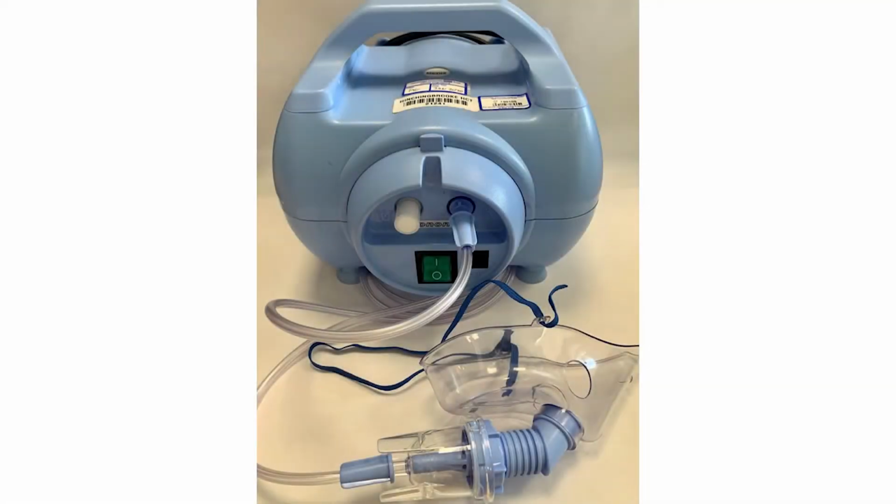What is a nebuliser used for? Generally, our patients will inhale medications as part of their treatment to help clear the airways and relieve symptoms. Most commonly, this is administered via a handheld inhaler, which is just as effective as a nebuliser.